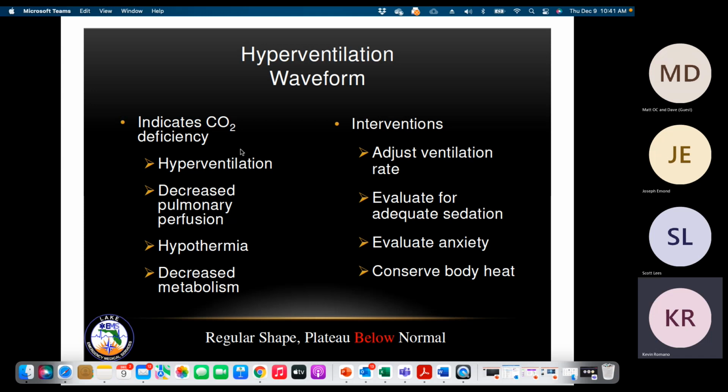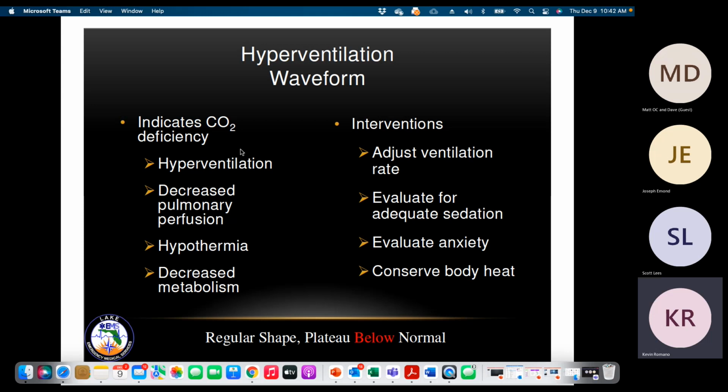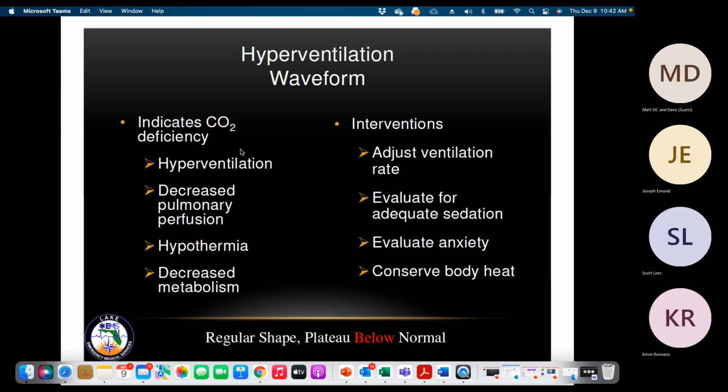So the rectal thermometers were initially purchased to confirm dead bodies. No, because I thought it was more because the oral thermometers did not go below 96. We needed something that went below 96. Yes, so that's another reason why we have them, but they were initially purchased because of the DOAs. I'm not going to get into why they end up on the truck over a recorded lecture. But we can be utilizing these for our patients, adult, pediatric, doesn't really matter, because we need to get a good core temp.